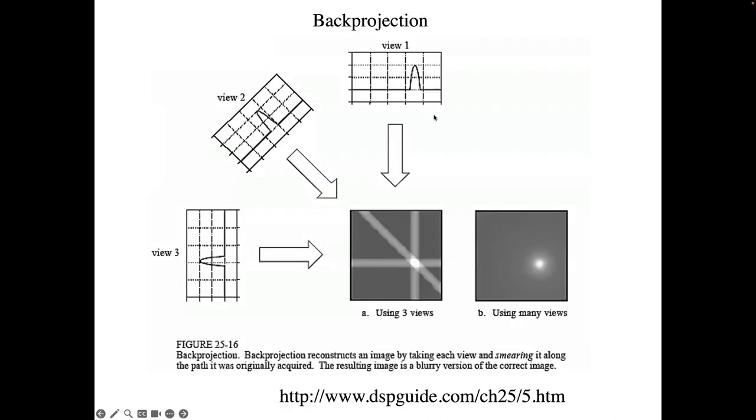And so it's interesting when you take this to the limit and you say, okay, we'll just do this projection, this naive projection, with many, many projections. So if we have a disk in the plane at some location and we take a projection here and I look along L, I see I've got brightness at a certain L here. And this blob function there is what the integral of a disk looks like.